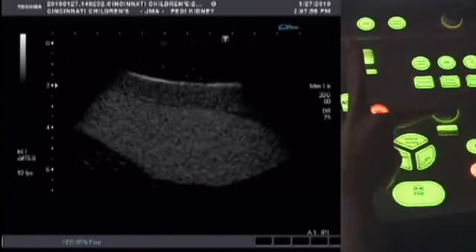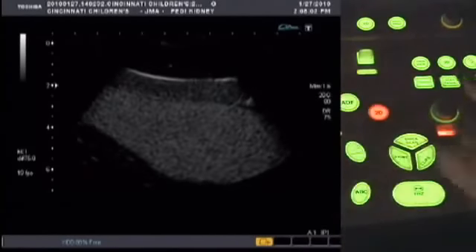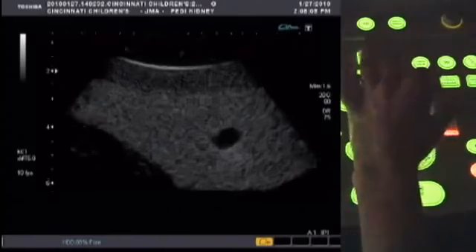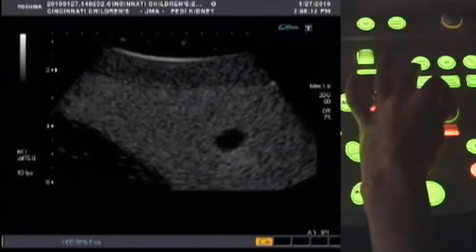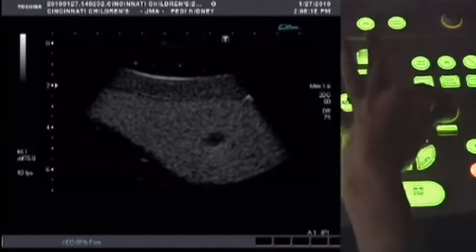Pushing down on the depth zoom button will activate the zoom function. Then turning the knob will zoom in and out. To change the depth, press the button again so it's on the depth function, then turn the knob.